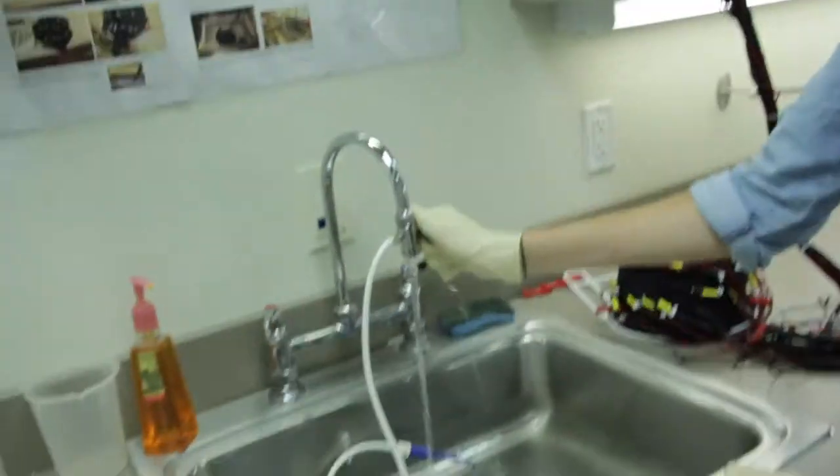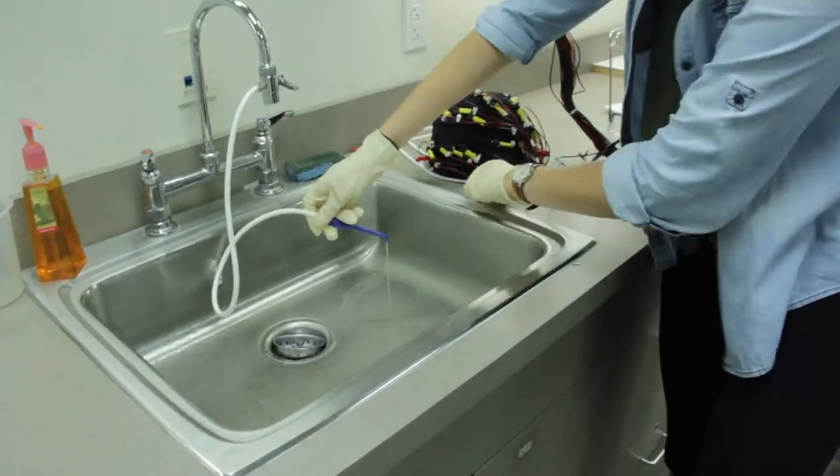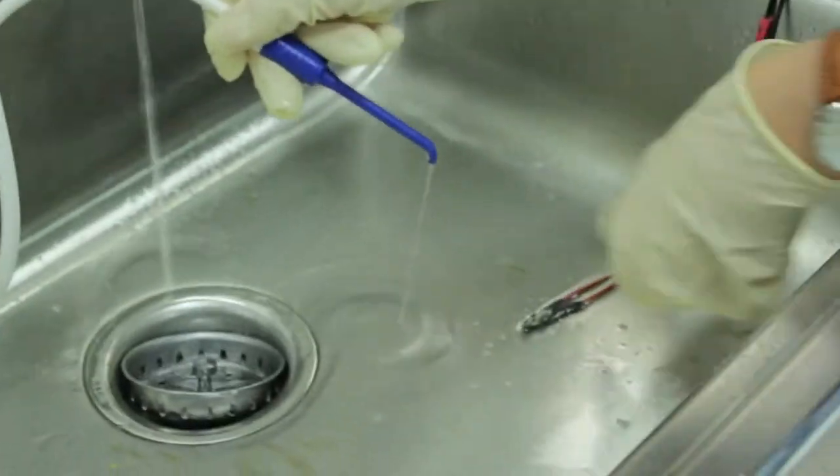After you have attached the red clips to the cap frame, turn on the water jet by moving the lever upwards. Use the jet to clean the reference and ocular electrodes.